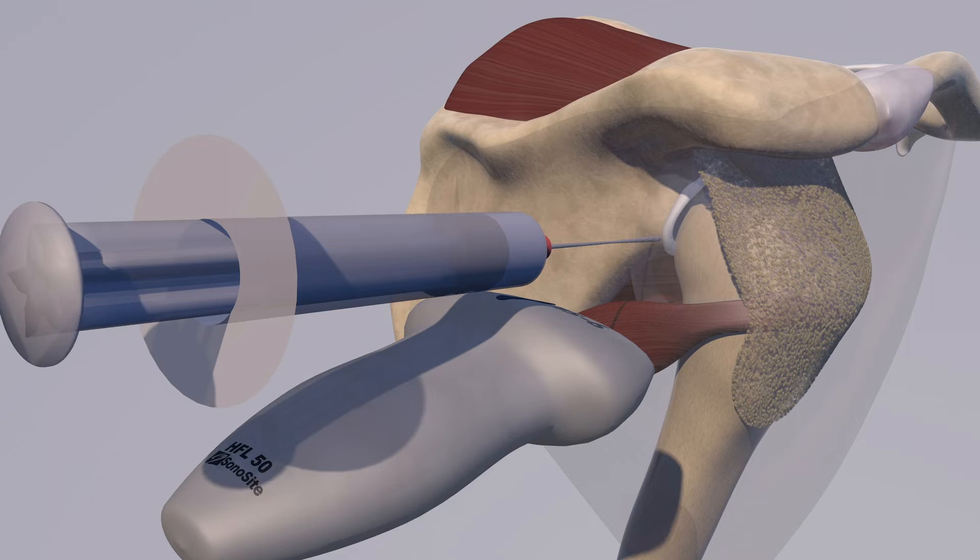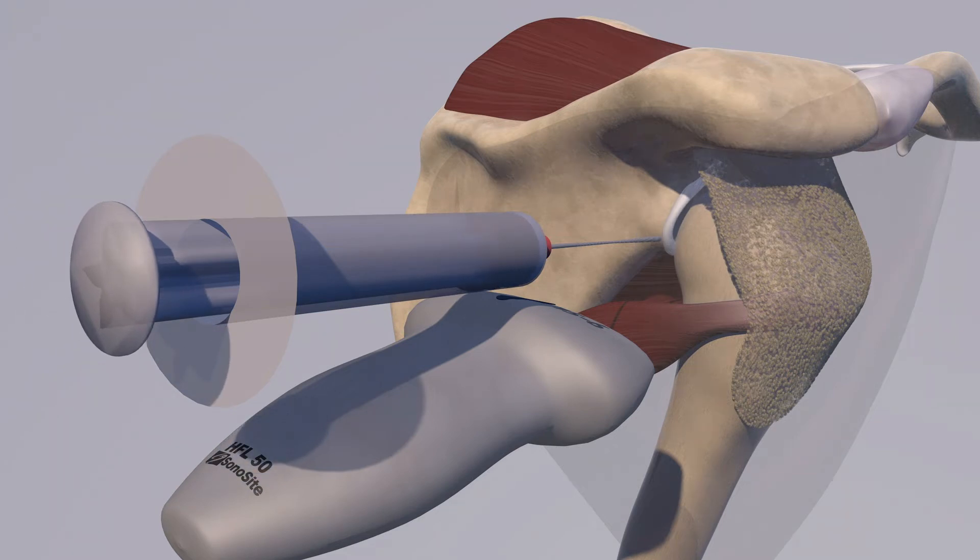Here's the needle going through the capsule — you can see how it's just poking through the capsule right above the labrum. The disadvantage of this procedure is that you won't see the shaft of the needle. However the advantage is that you can do a direct approach using a one-and-a-half inch needle right into the shoulder joint, and you can get a good sense of where the needle is by the jiggle technique — essentially just moving the needle back and forth to sense its location by the movement of surrounding tissue. If you go slowly and walk the needle down towards the joint, you should get in with no significant difficulty, and patients tolerate this technique pretty well.